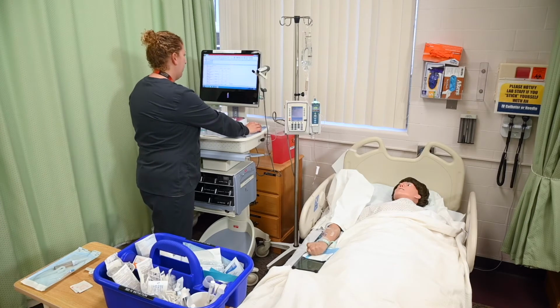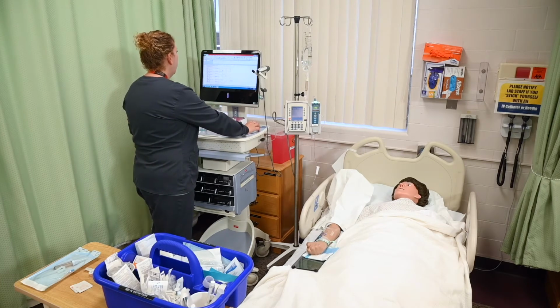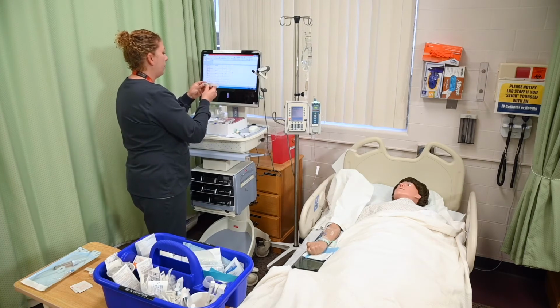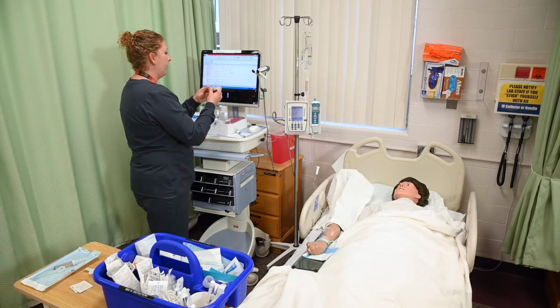IV practice, date of birth 3/3/87. Ceftriaxone, 1 gram IV Piggyback daily. The time is now. I have ceftriaxone, 1 gram IV. IV practice, date of birth 3/3/87. 0.9 sodium chloride, 10 ml IV push PRN flush. I have sodium chloride 10 ml flush syringe. IV practice, date of birth 3/3/87. 0.9 sodium chloride, 10 ml IV push PRN flush. I have 10 ml sodium chloride flush.